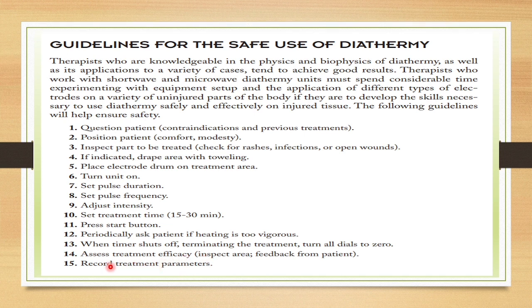So always we need to record the treatment parameters, as well as all the things regarding the patient which you are encountering in your clinic or in a hospital setup. Documentation is one of the important things that you will be studying mainly in your PG, how documentation will be important in order to protect yourself. So these are the guidelines for the safe use of microwave diathermy.